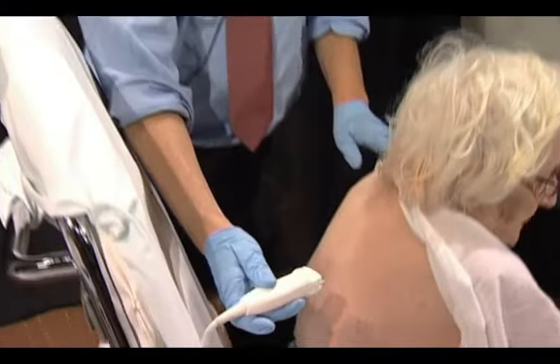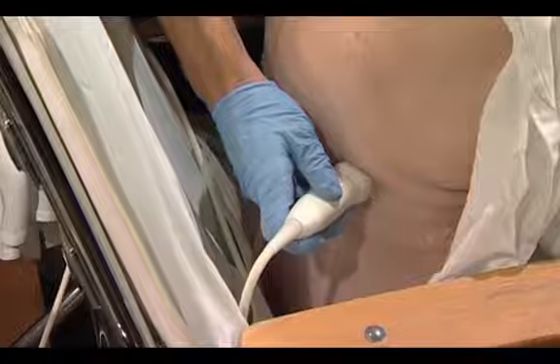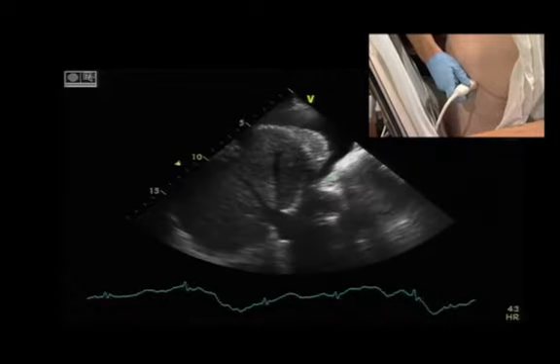Even though it's possible to image the lung even in the normal position that you image patients for echo by moving the transducer more towards the lung, it's probably advisable to let the patient sit up and image them directly, like the patient that I'm going to show you now. What you do is you just start somewhere at the bottom and just move the transducer upwards. And here you can nicely see the echo-free space and also the lung tissue.